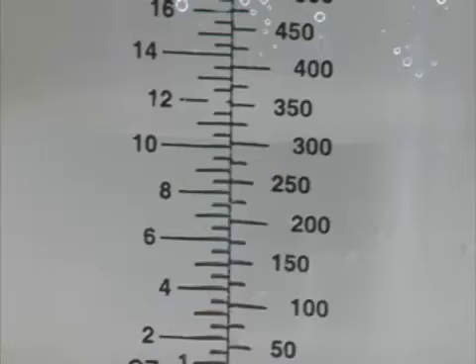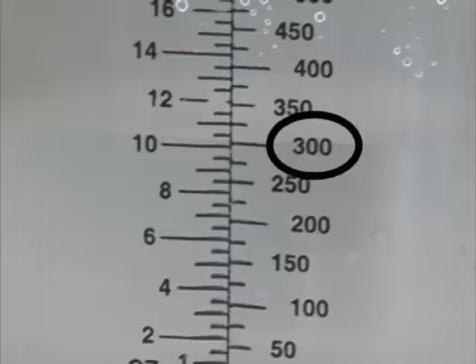So when you're reading the graduate, you want to make sure that you read in cc's. And as I read up here, I can see that the urinary output was 300 cc's. And just to explain how this works, you have to understand that each one of those lines represents 25 cc's. So if you go from the bottom, you have 50, 75, 100, 125, 150, and so forth. So the urinary output for this patient was 300 cc's. So my next step is to record to make sure that I am accurate.